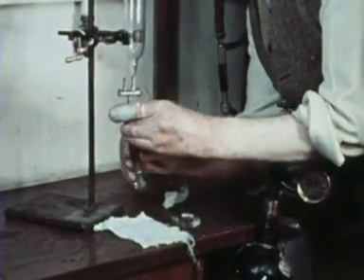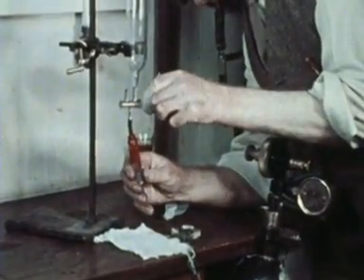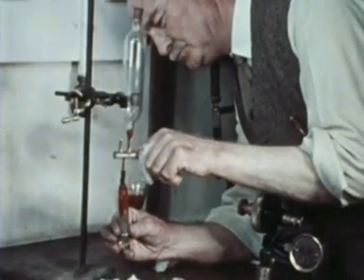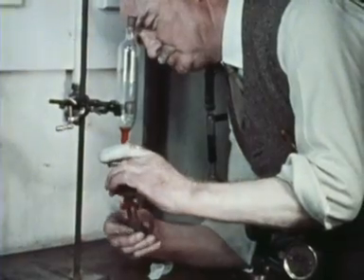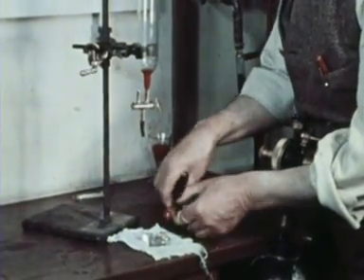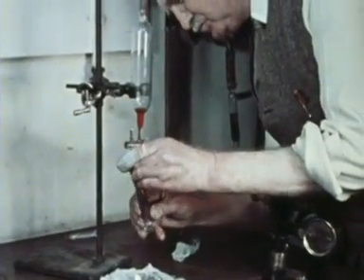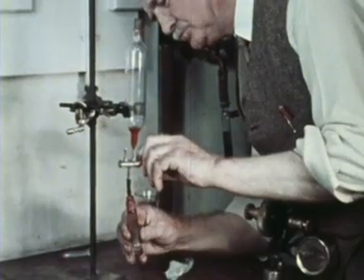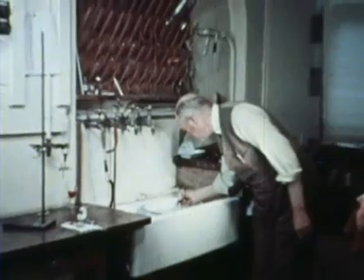Now for his blood sample. Notice how careful he is to preserve a drop of mercury in the bottom. This will enable him to purge air from the tap when he comes to remove the sample for analysis.